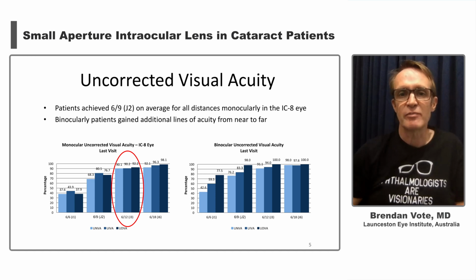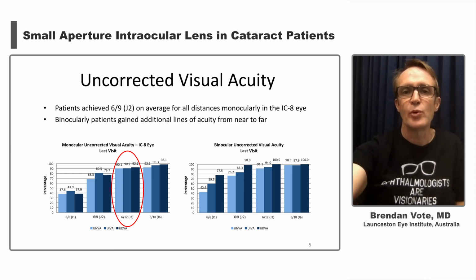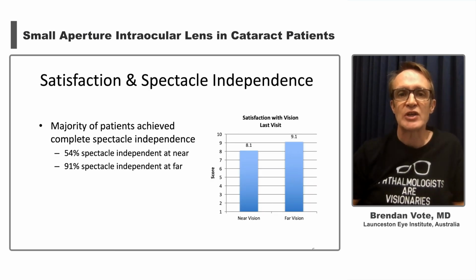More than 90% of patients obtained better than 20/40 vision at all distances monocularly in the IC8 eyes. But more importantly, binocular uncorrected vision revealed 98% of patients achieved uncorrected distance vision of 20/30, and 94% uncorrected intermediate vision of 20/40 and 91% uncorrected near vision of 20/40 or better. Patient satisfaction at both distance and near was excellent, with 84% of patients happy to recommend the IOL.